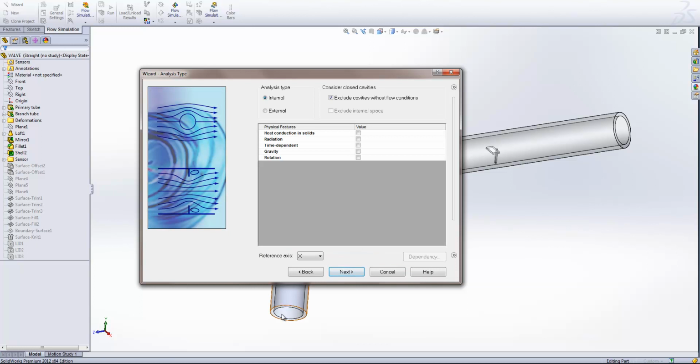Okay. So next we come through to select our analysis types. This is where we start setting up our study parameters. So first of all, we know we've got an internal study here because we've got a closed off set of pipes, and we're studying the fluid flow inside those pipes. By all means, if we wanted to conduct an external analysis, so for example, we could study the exact same thing but have air blowing past the outside of the tube, we would select external analysis. We could still close off this volume and have an internal flow inside an external analysis.